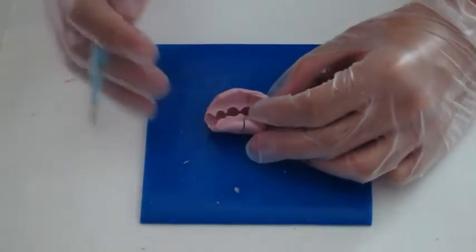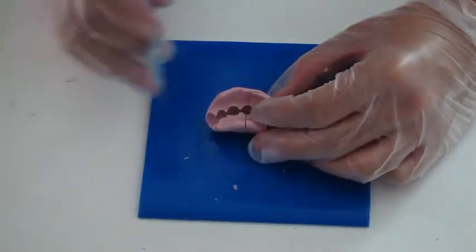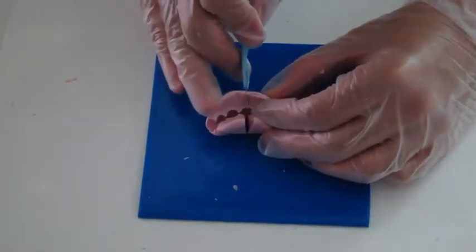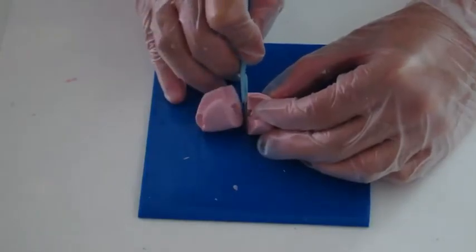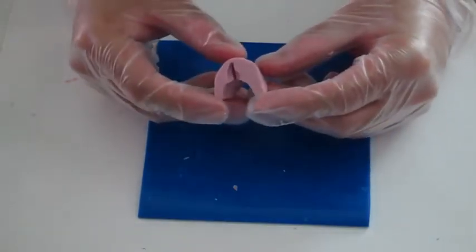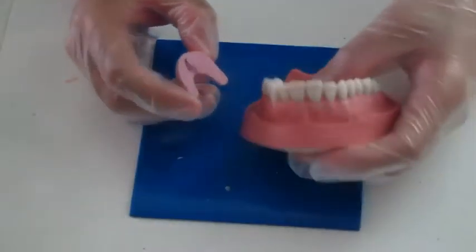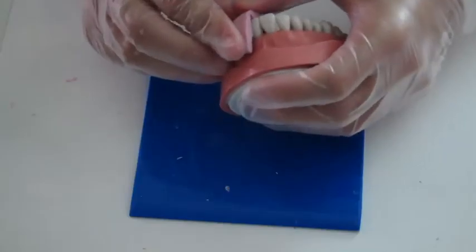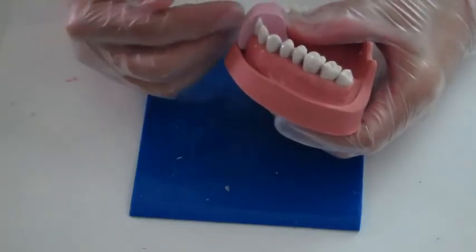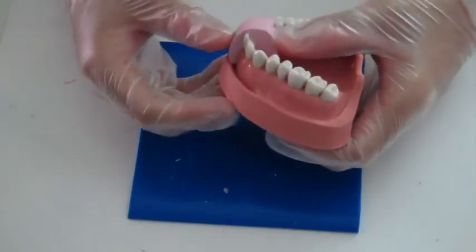When you are doing this, place a plastic pad on the working station. Now you can see the proximal profile of the silicone index. You can see the silicone index is well adapted to the contour of the tooth, and that's what you need.